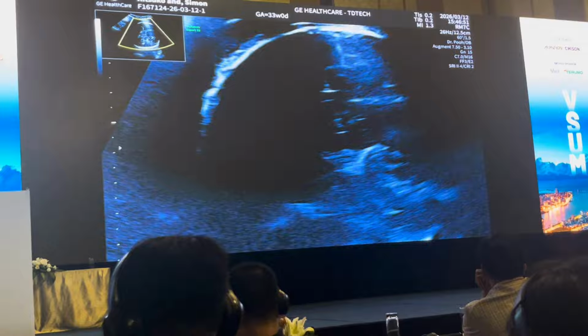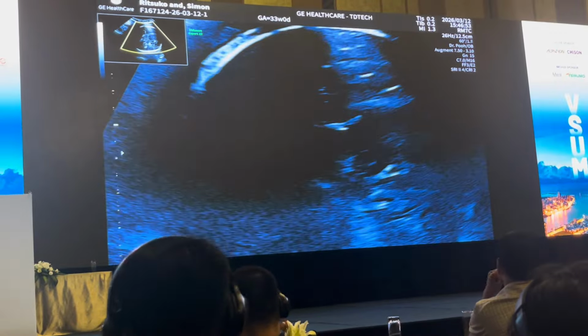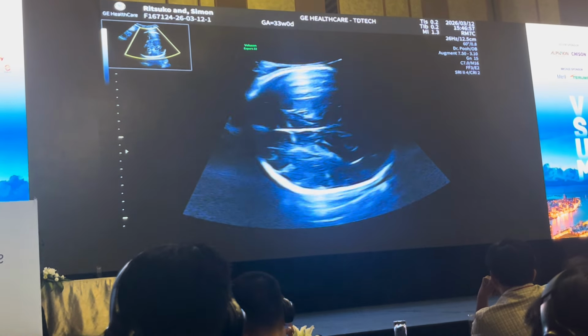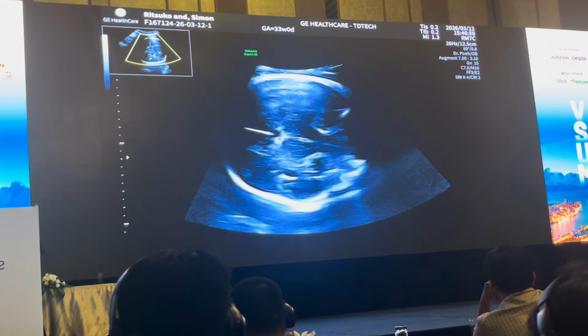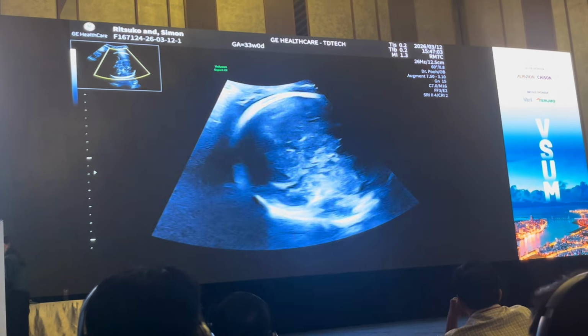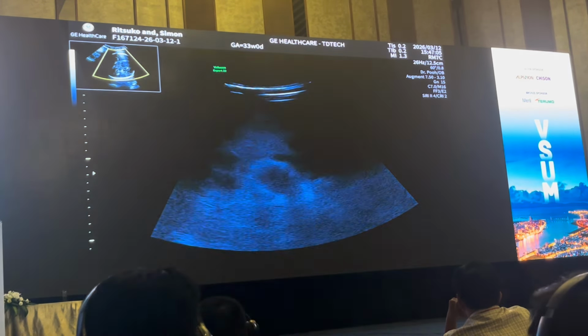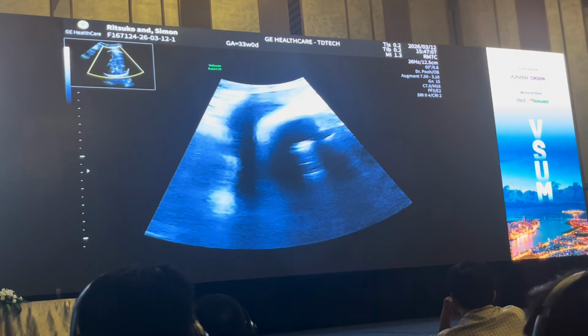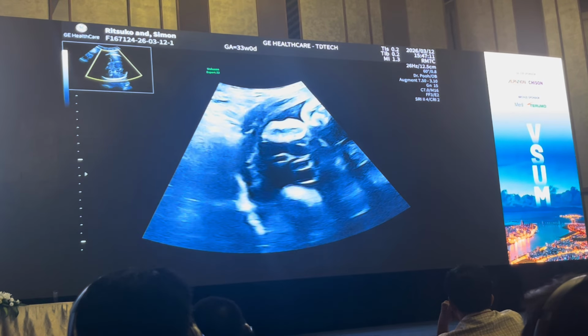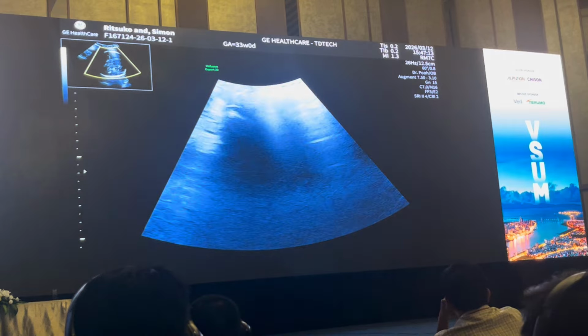It's a very good point. And just before I leave it, to answer Nguyen's question, the baby, when we look at it, is in a difficult position to get the corpus callosum. We're not going to do a vaginal scan, but when you come around trying to get the baby into a sagittal position, it is very challenging. So what do you do when you cannot get that sagittal position of the baby's corpus callosum?